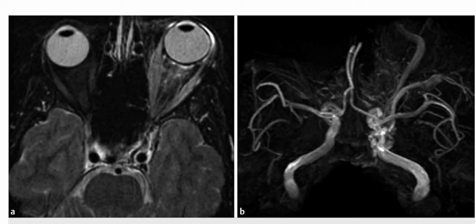Also there is enlargement and edema involving the left extraocular muscles, inflammation of the intraorbital and periorbital fat, and proptosis as well. This three-dimensional volume rendered reformation from the MR angiogram is showing that there is increased signal or flow within the left cavernous sinus and the left superior ophthalmic vein as well.